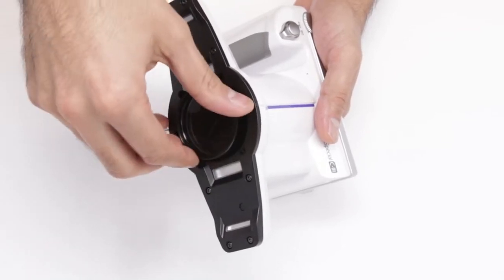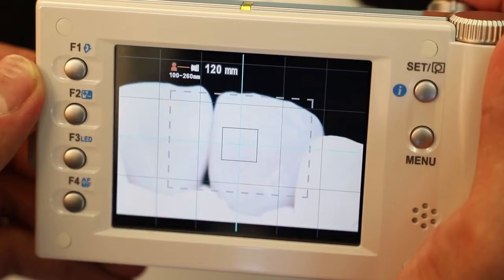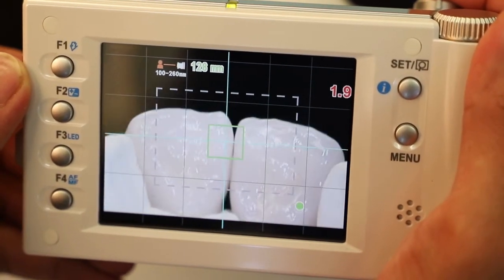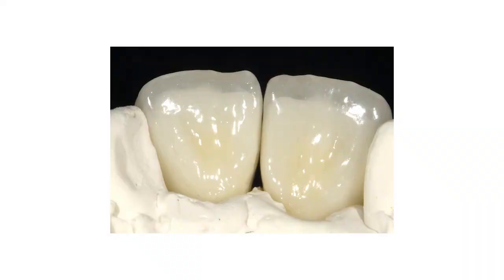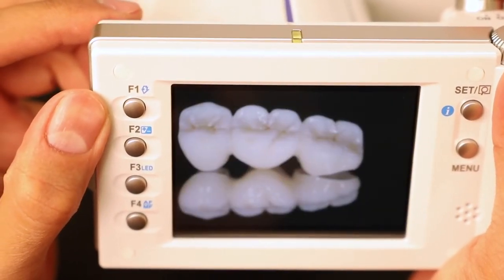This mode is very helpful for the documentation of minimally invasive treatments and detailed tooth characteristics. Like the other modes, Telemacro produces high-quality images without the need for additional light sources. You can reliably take pictures with a mirror, which are ideal for patient information.